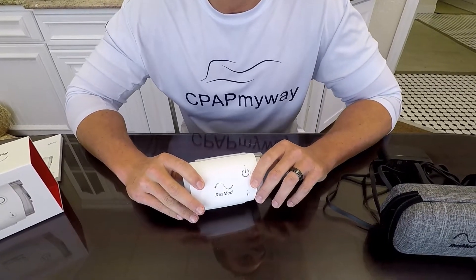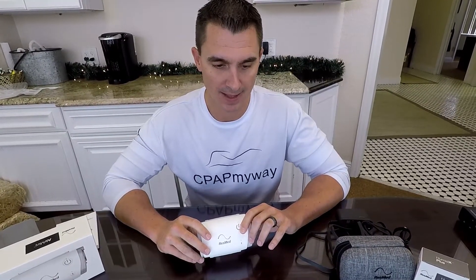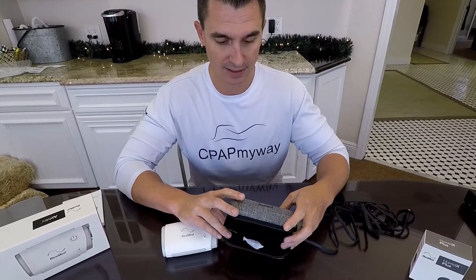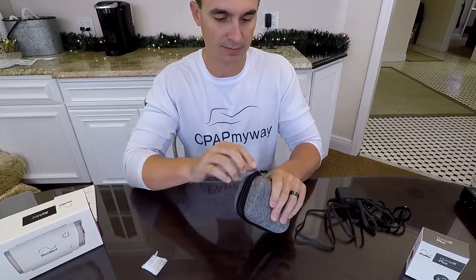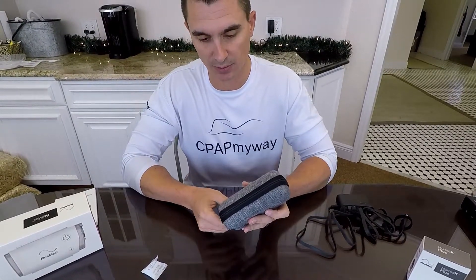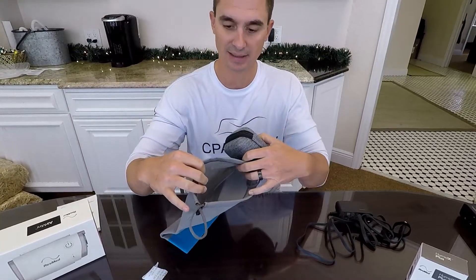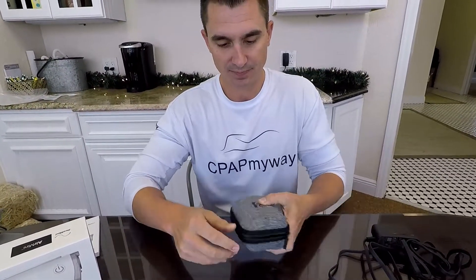We have four masks that fit the Air Mini: the P10, N20, F20, and F30. For demo purposes, we're going to use the N20 today with the N20 adapter. The accessories available include a couple of different travel cases. The hard case is the one I recommend most — it's kind of like a sunglass holder, zips up, and keeps it safe in your luggage. The hard case will actually slip into the soft bag along with the rest of your supplies, so your mask and tubing fit in there really well.